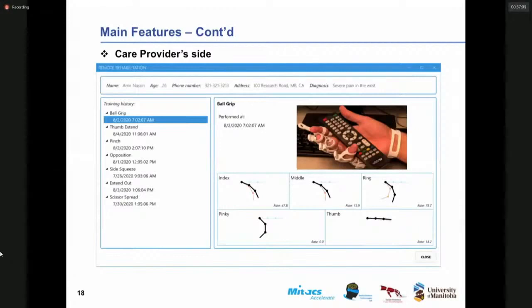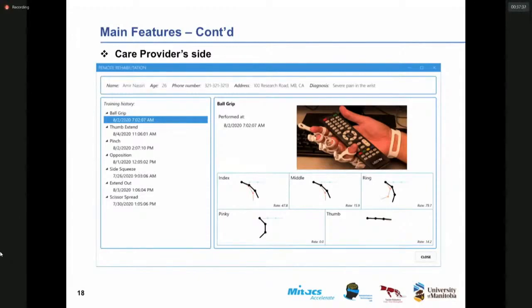This is a screenshot of one of the pages of the desktop application for the care provider. The patient's information can be seen on the top, including the name, age, phone number, and other details. The training history is shown along with the video of the patient's task, the date, time, and graphical KPIs showing the range of motion of the fingers for the patient.